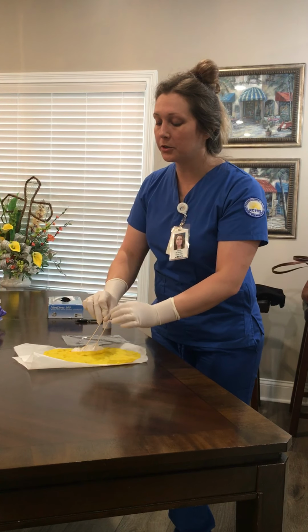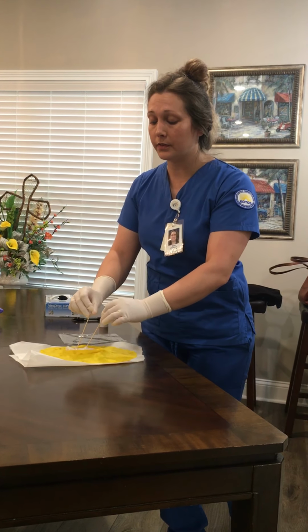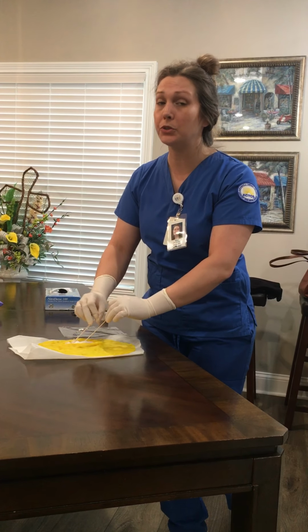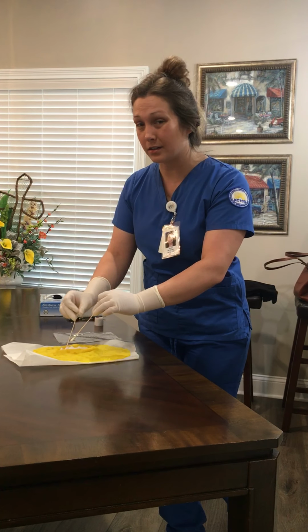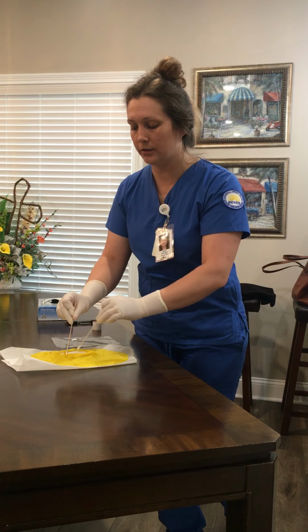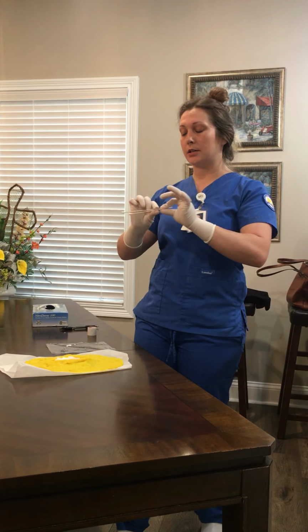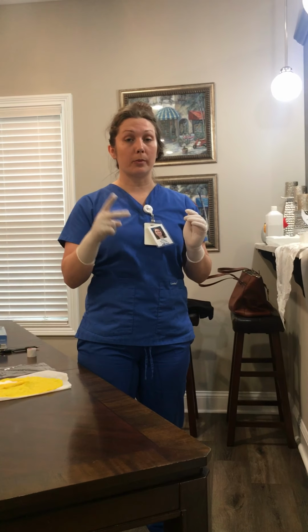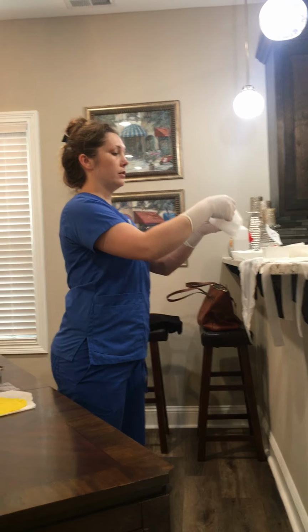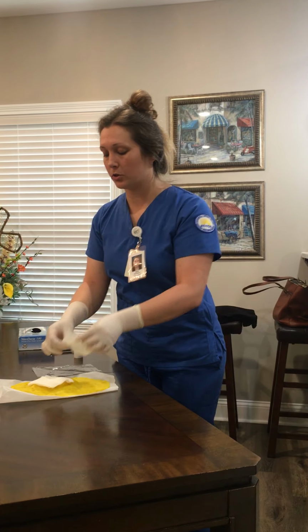So you wanna pack your wound using these. You wanna make sure that you have enough packing in there, but you don't wanna have too much. You don't want it to overlap on the skin because that could cause maceration and you don't want that. So once I've packed my wound with my wet gauze, I can now discard these cotton tip applicators. And now I need 2 4x4s that are dry to place over my wound. So I have my 2 4x4s, my dry ones, and I'm gonna place them over the wound.